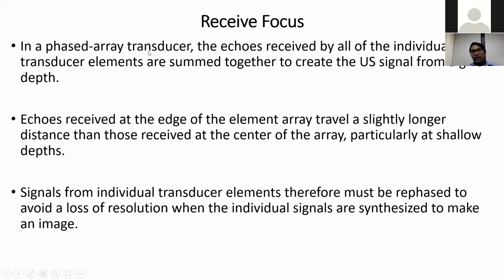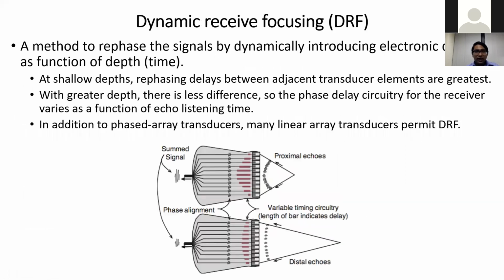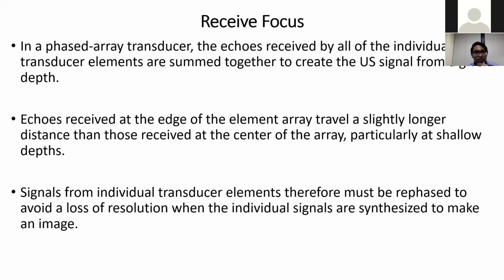So in phased array, there is a little bit of difference from the linear arrays. In linear arrays, we were focusing a subaperture. In phased array, we focus all the transducer elements together.